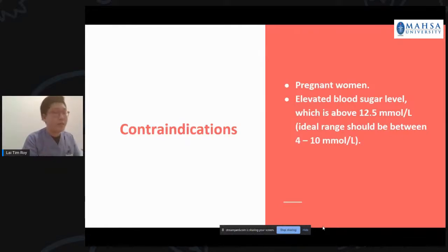well. I will show you all the images later why it is not suitable, because when the sugar level is high in a patient's body, there will be some uptake at the patient's muscle. Therefore, it will create not very clear images for the doctor to review. I will show you all the images in a while. Muscle uses a lot of sugar, which causes more diffuse uptake of the radioactive tracer at the muscle. So it might obstruct the tumor site. Therefore, it's really hard for interpretation.